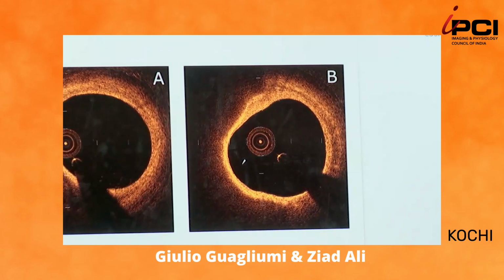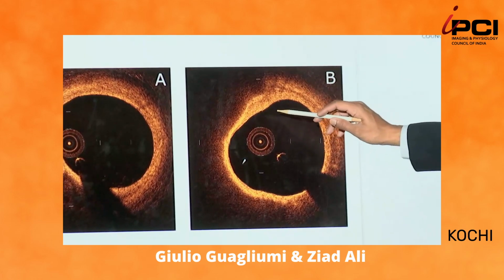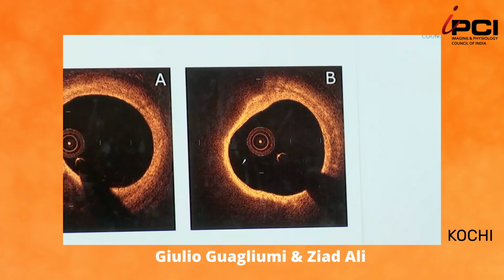Let's poll the audience. How many say A? Hands up. Hands up, come on. How many say B? Okay, so we have some work to do. Okay, so what you have in B... That is very important. This is the essential of the imaging, the essential of the baseline.